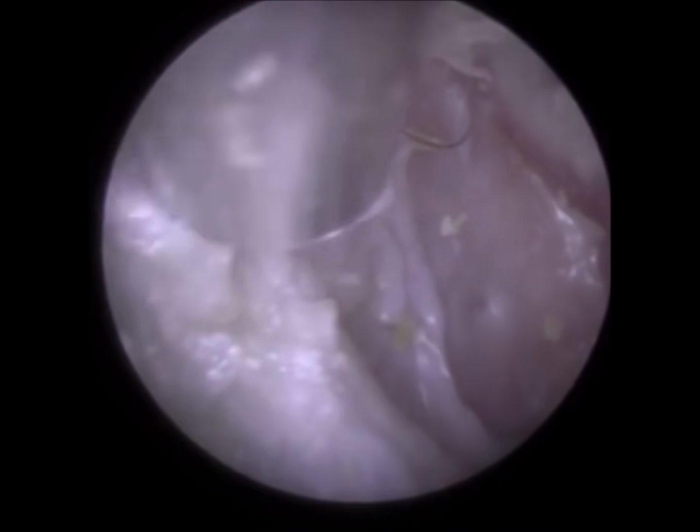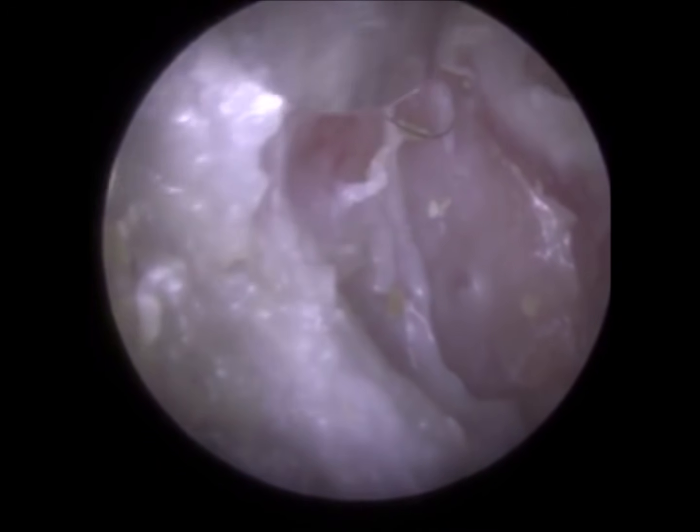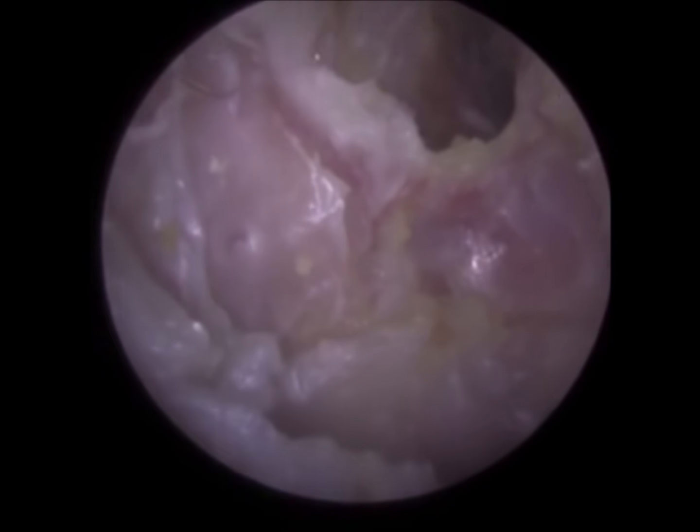559, most challenging eardrum skin peel. It was a 20-minute procedure. There was absolutely no way you could use a forceps to remove a thin layer of skin from the eardrum, and they've been quite insulting. I should learn to use forceps and peel it, and I don't know what I'm doing, basically.